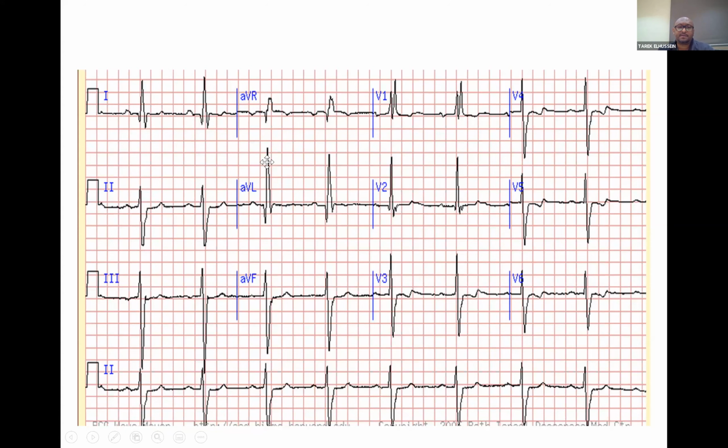So this is sinus rhythm, okay? And you can see the P wave is a little bit prolonged here with biphasic appearance, okay. So this is suggestive of left atrial enlargement. How is the PR? The PR is slightly prolonged, okay? So there is also a probable first degree AV block here. Look for any other P waves. I don't see a clear one.